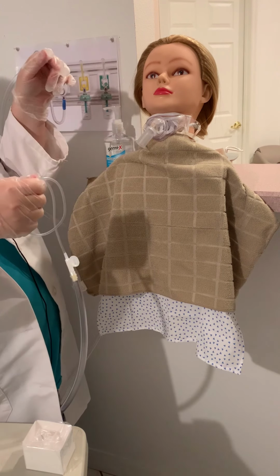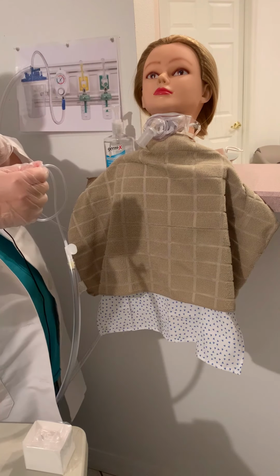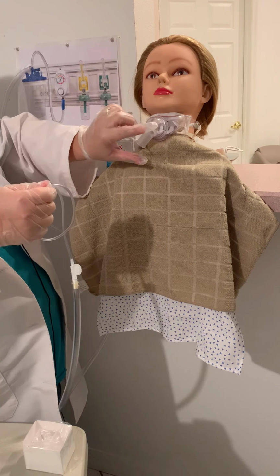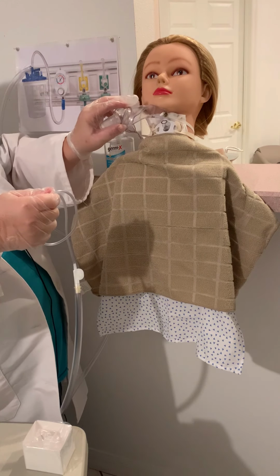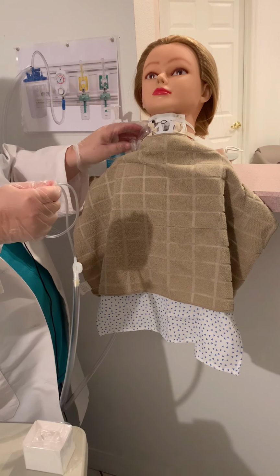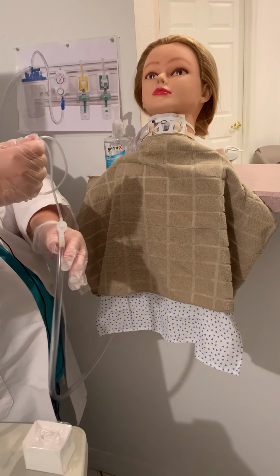so it doesn't hit anything. All right, so we are going to let the client know we are ready to begin. So I am going to move the oxygen mask off to the side so I don't have as much chance of hitting it with my hand when I go down.